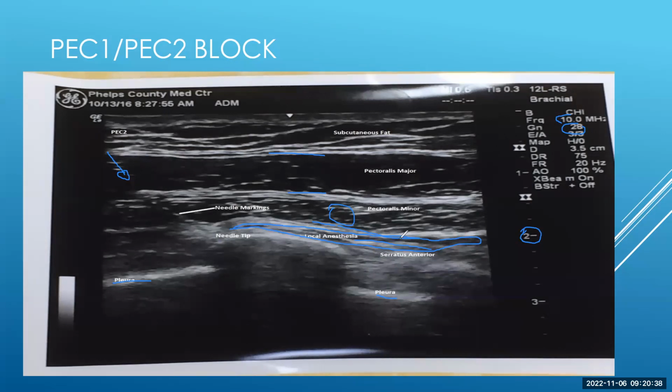and that's all local anesthetic. And so that's a good utility of ultrasound, avoiding vascular structures, avoiding the pleura, as we can see here. And without this, could you palpate the rib and come in contact and inject? Yeah, I mean, sure you could. But seeing is believing.